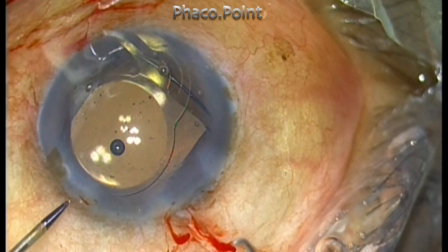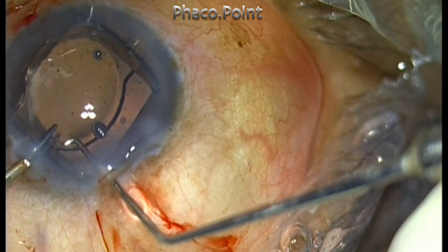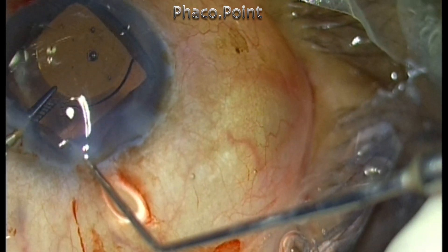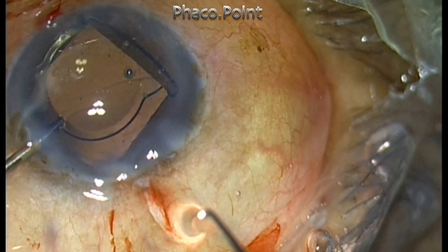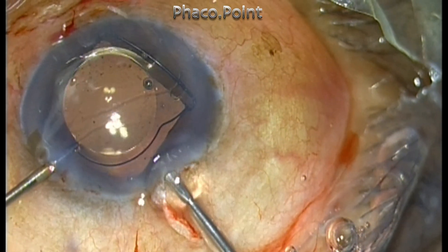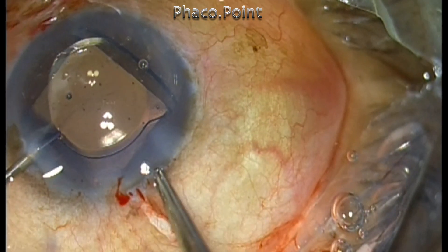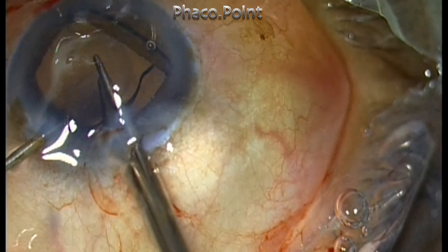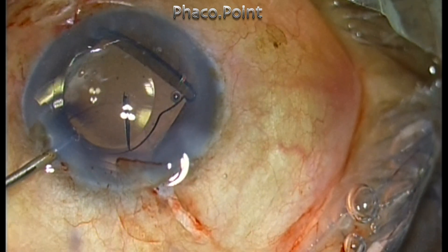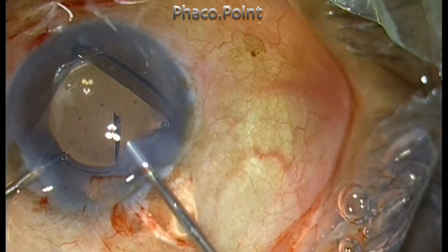Using a Sinskey hook, the optic of the lens is fed to the intraocular forceps. Try to grasp the lens at the junction where the optic and the haptic meet, as that's the most favorable place to hold the lens. The cutting of the IOL optic is done with Vannas scissors — I'm just using simple Vannas scissors, which is the most effective way of cutting the lens, as most intraocular scissors I've used tend to get blunt after just a couple of uses.